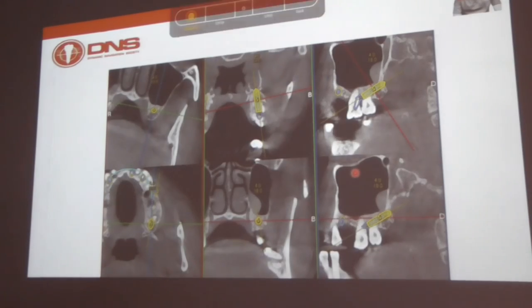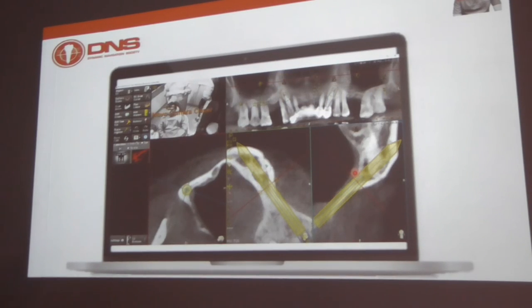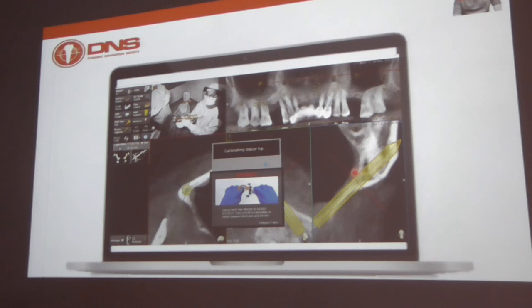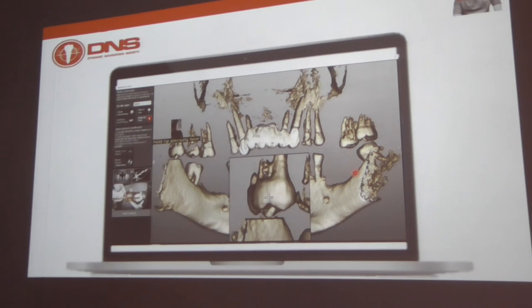Only thing is planning for pterygoid, which again is just the routine planning. And this is the video for only the placement of pterygoids and not for zygoma. In my personal opinion, pterygoid is more tricky than zygoma, because with zygoma you are seeing everything. With navigation, you won't go into the orbit, so no stress. But with pterygoid, if you miss it, you don't get your torque. Zygoma, you will get torque most of the time. So if you're able to place pterygoid, then you're able to do zygoma, absolutely no problem. It's the same concept.